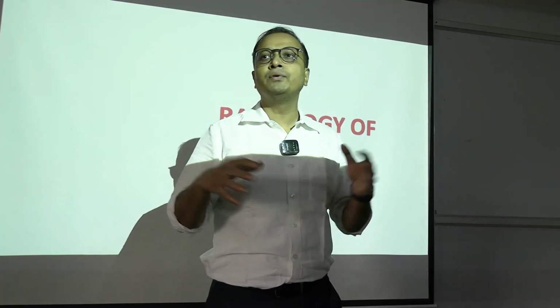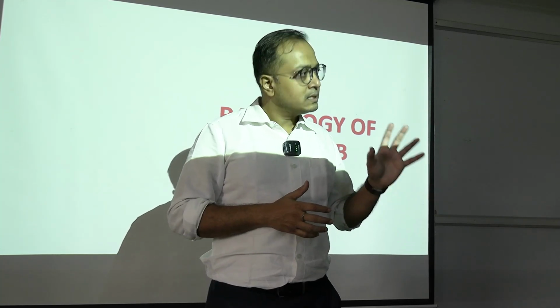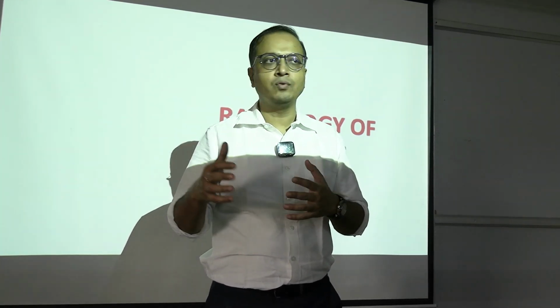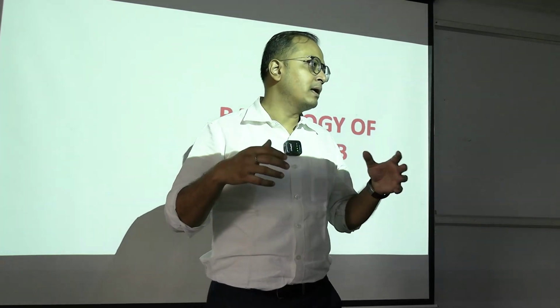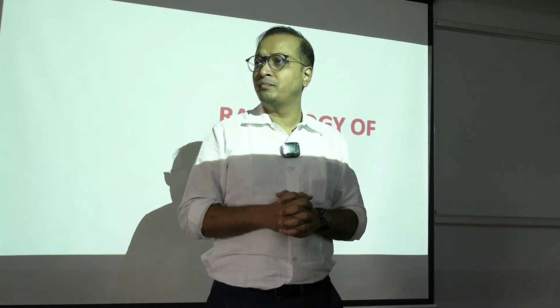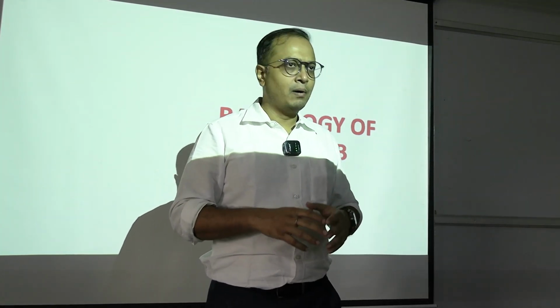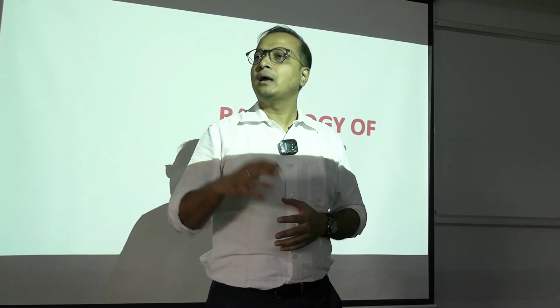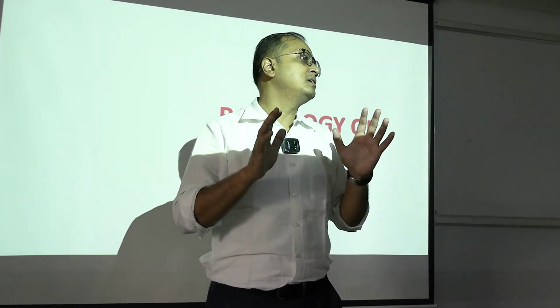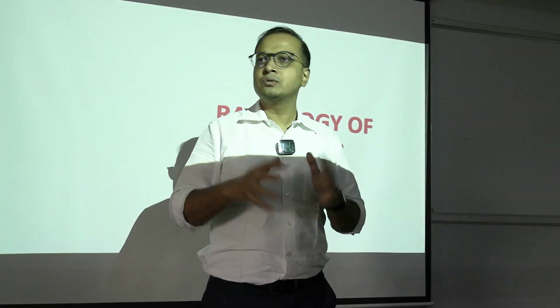So these are the normal views that we encounter of this particular region. There are several other views as well, other than this anterior view and posterior view: oblique views, the OM view, the skyline view, etc. Different views are there. As we graduate higher and higher, we will come across them. But in 90% of cases, we see these three views predominantly as X-ray skiagram views, right. So, we understand the views over there.